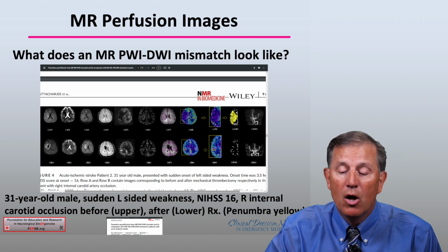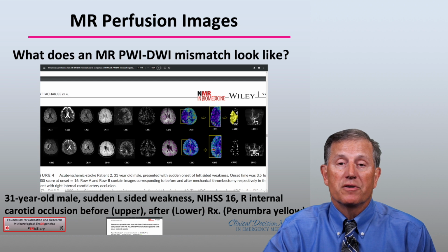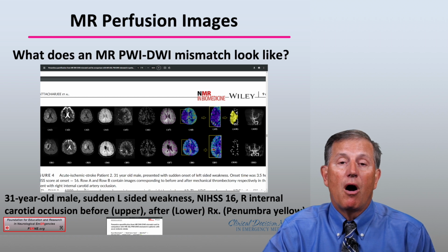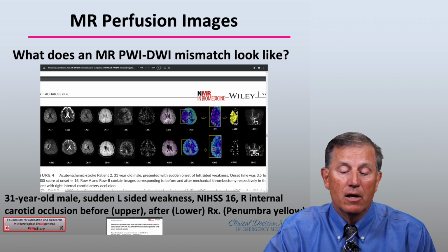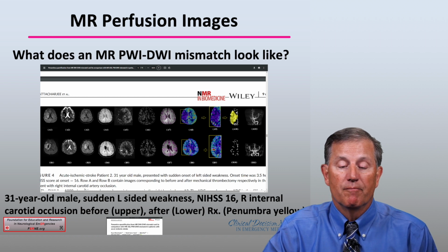And you'd say, well, what was identified at the time that they did a non-contrast CT, a CTA, or CT perfusion? Remember, in patients in whom the likely scenario is a middle cerebral artery occluded due to some thrombus or embolus, you might use the MR as an alternate therapy or diagnostic for determining the cause of the stroke in patients that are not typical, those who are young, for example, as compared to older patients.